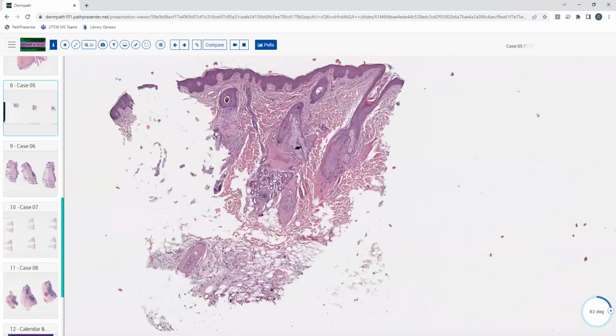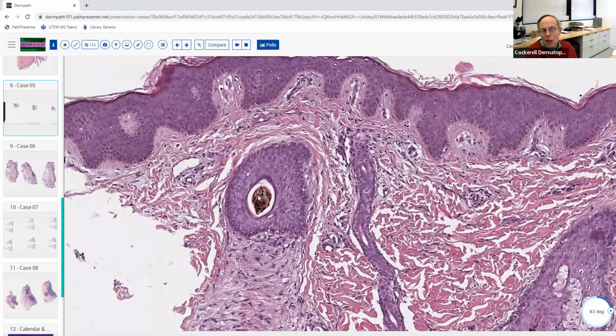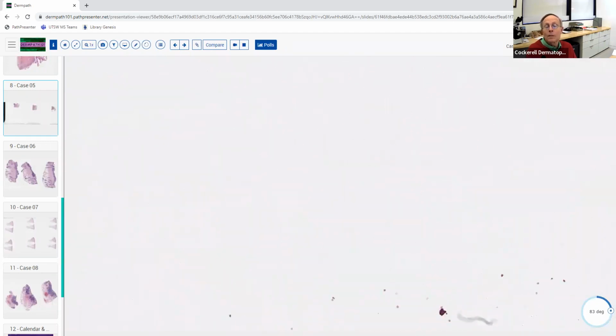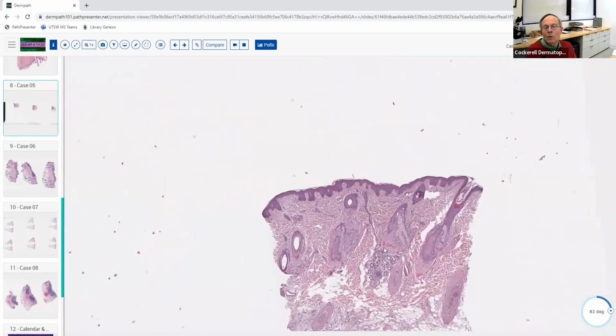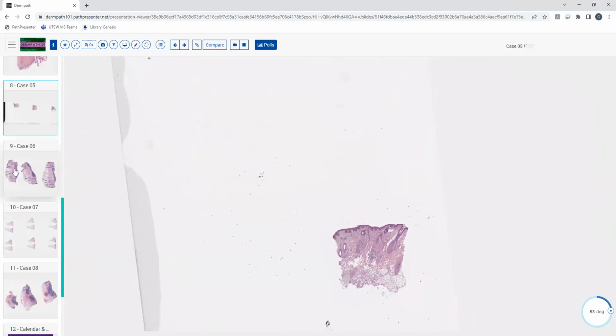Now, this is another clue. You see trichomalacia a lot of times in patients that have alopecia areata, because they start losing their hair and then they start twisting it and saying, wait, my hair's falling out, and they help it along. And so they commonly get a combination of trichotillomania and alopecia areata. So you see that together quite a few times, actually. So this isn't just purely trichotillomania. That also doesn't give you this synchronization of the follicles here.